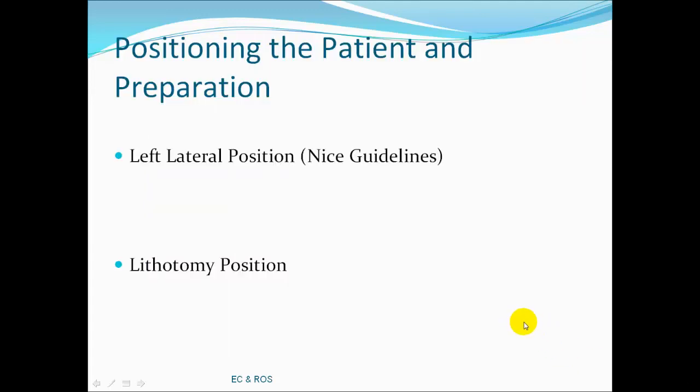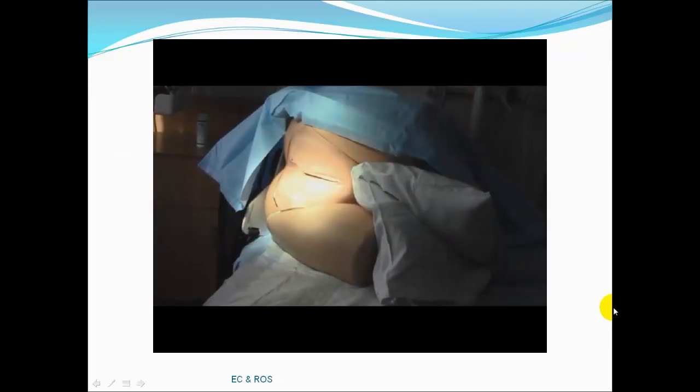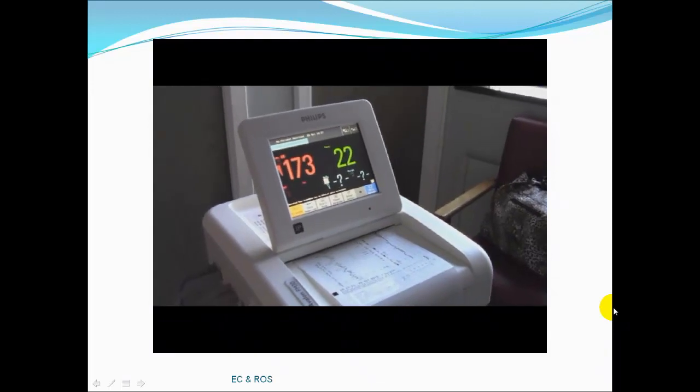Positioning the patient. While the lithotomy position can be used, the left lateral position is recommended. Positioning a pillow between the legs aids comfort and maintains a stable position. External fetal monitoring must continue throughout the procedure.